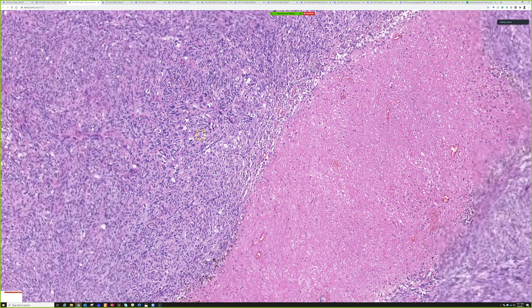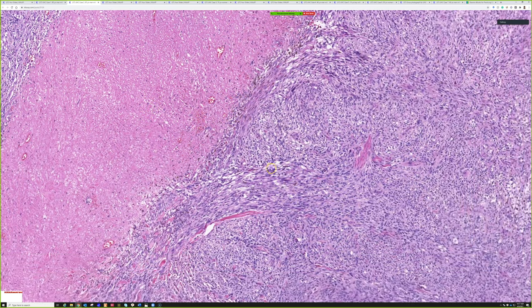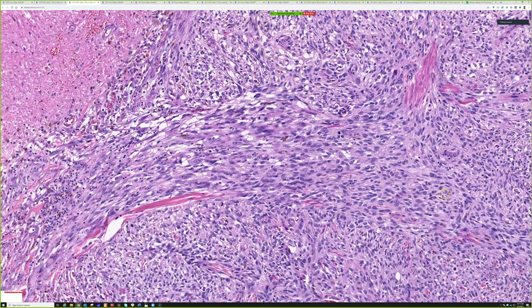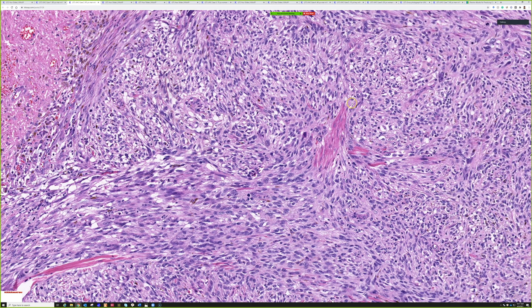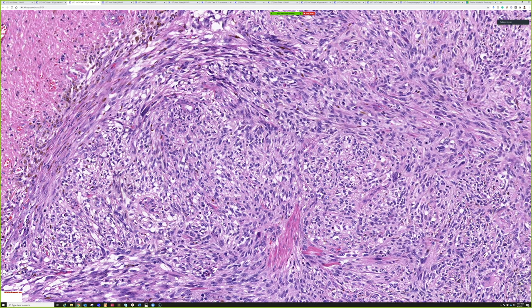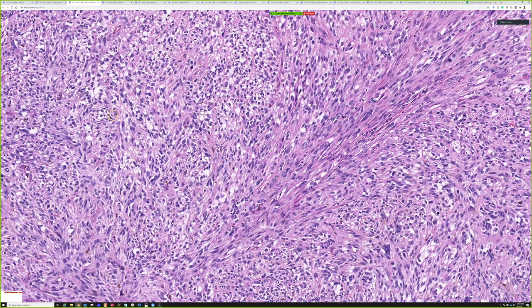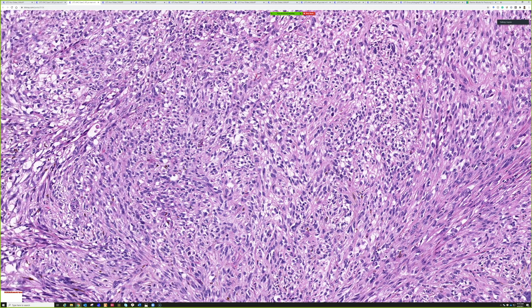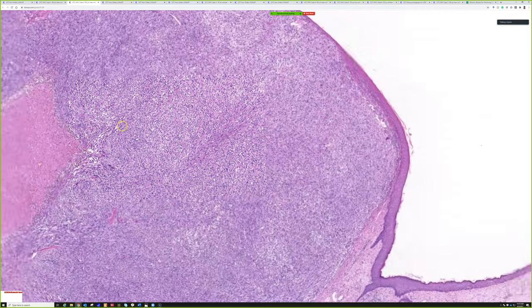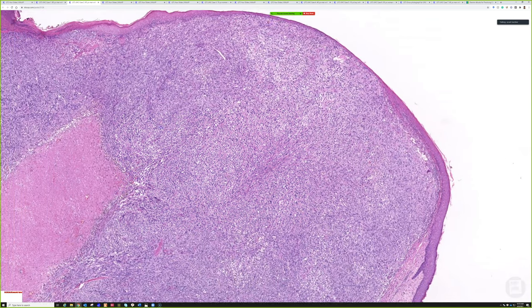On higher power the cells look very spindly. There is also a lot of pigmentation appreciable on both low and high power, raising the possibility of metastatic melanoma.